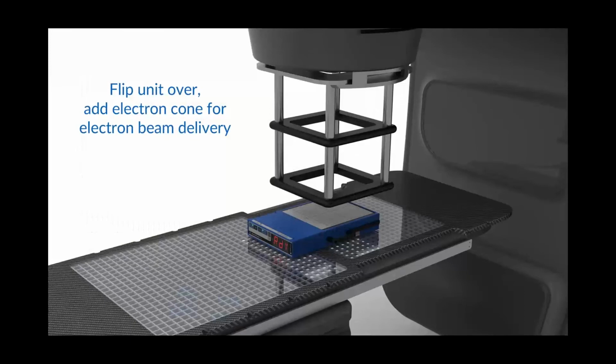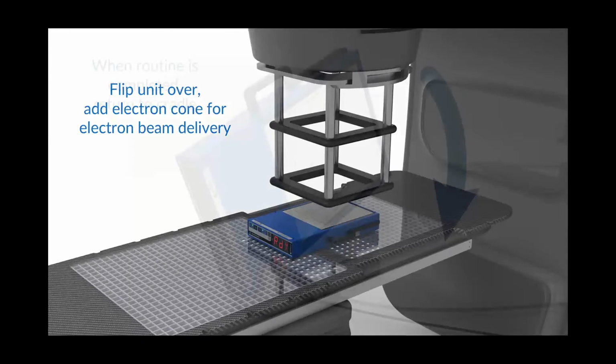If everything's well with the photons, the only time you really need to go in and address the unit is when you put on your electron cone. You flip the unit over, align it for your electrons, and you're ready for your electron deliveries. And the same procedures go for electrons as photons. You just deliver the beams in the order that you see fit, and it will automatically recognize those and move forward for you.